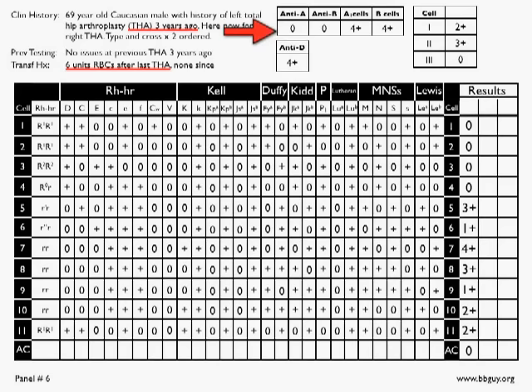And when we look at the panel, we see again, the screen, we see that we have reactions in cell 1 and cell 2. Again, remember, immunohematologists and blood bankers around the world, when they see positive reactions in 1 and 2, usually think anti-D. In this particular case, that may not be the right answer. Let's go down to the panel and let's look at again and see what we can learn.